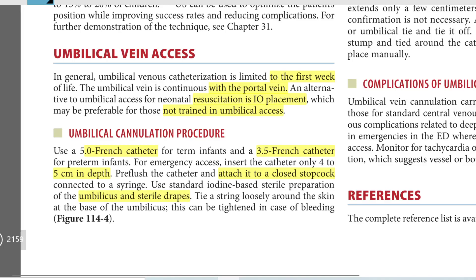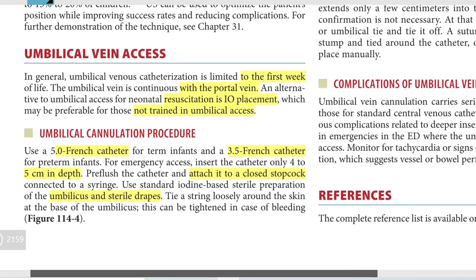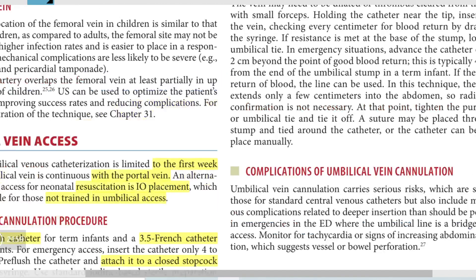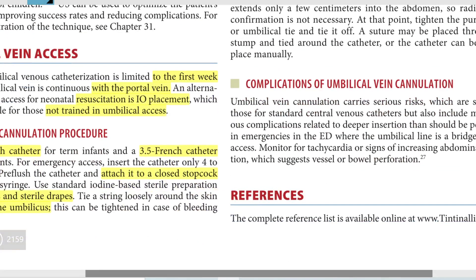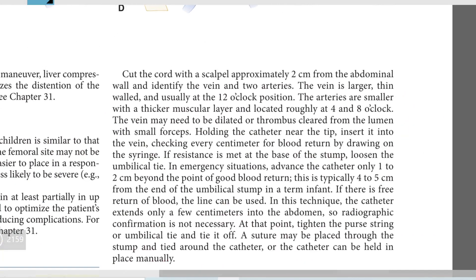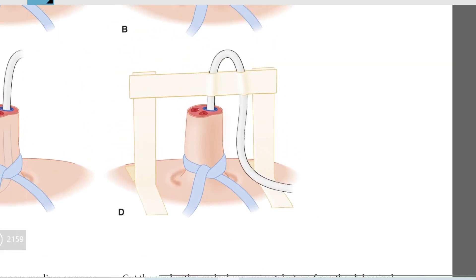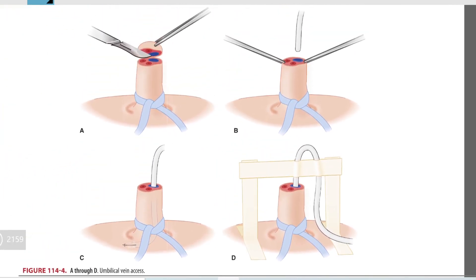Tie a string loosely around the skin at the base of the umbilicus. This can be tightened in case of bleeding. Cut the cord — this is how you cannulate it.